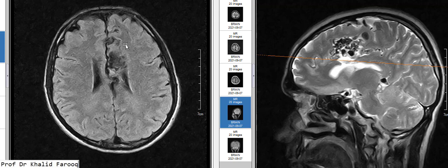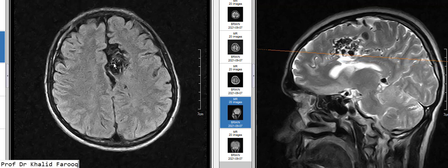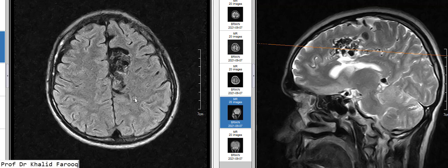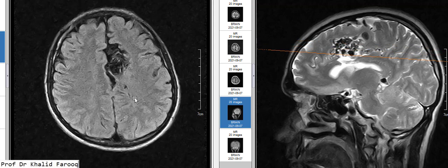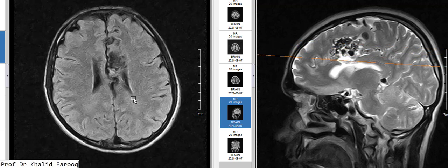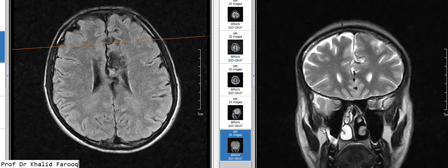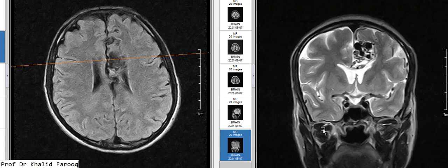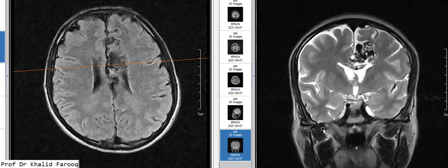Let's see the FLAIR sequence. Here we can see the major portion in and around the AVM is unremarkable. There is no hemorrhage in the present study. We can also see the coronal T2-weighted sequence, where we can see the anterior cerebral artery — this is the bunch of vessels just above the corpus callosum.